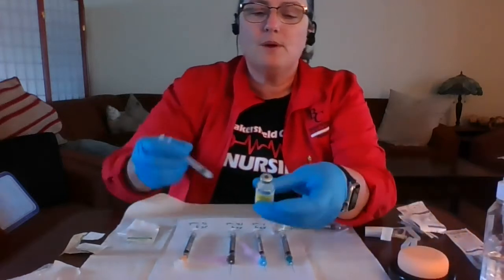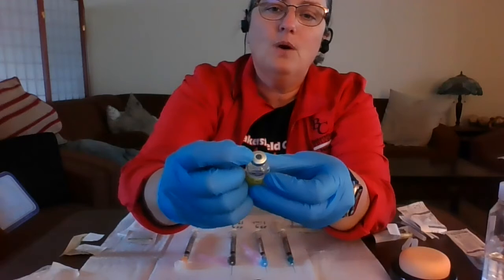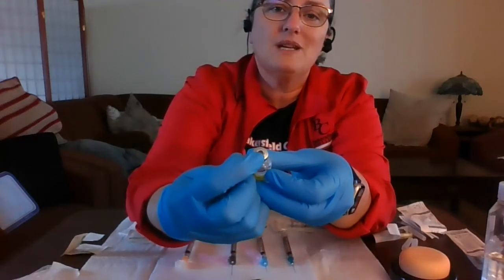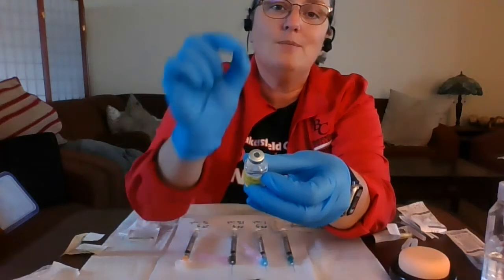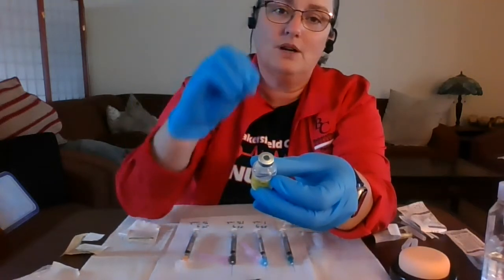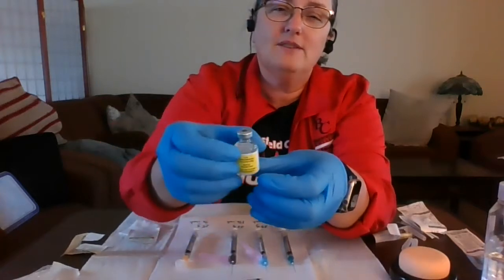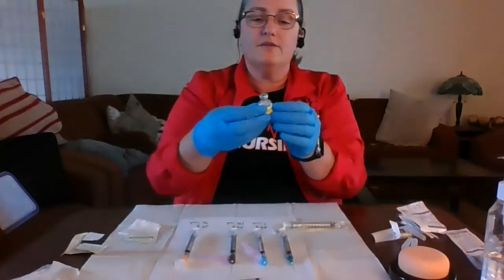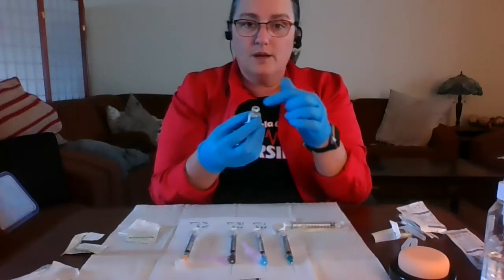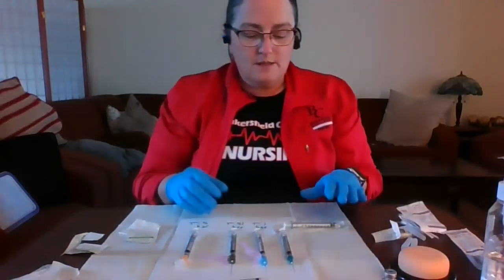And then a little bit about this rubber stop. I'm going to just use this to point to it. If you are inserting a needle into it multiple times, you kind of want to start making a circle around, because every time we breach that rubber, we are making a little bit of a hole, and eventually we're going to core it out. So we kind of want to move around. I think the vials that we're seeing most often for vaccines were entering five to seven times. So we want to make sure that we're not going into the same place every time. So that's about the vial.